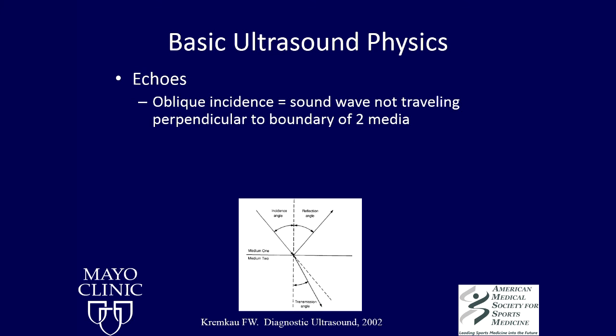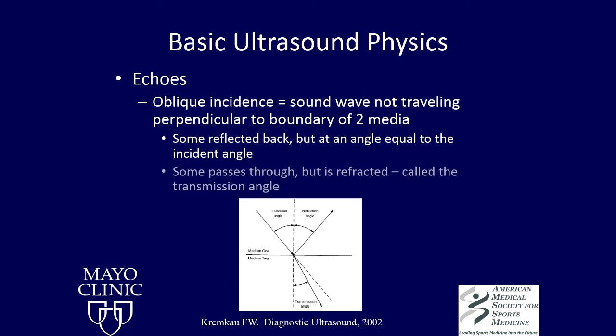If the sound wave strikes that tissue boundary at an angle, then some of the sound wave is going to reflect up into the distance, and some of it that passes through is going to get refracted. And all of that is based on the acoustic impedance.